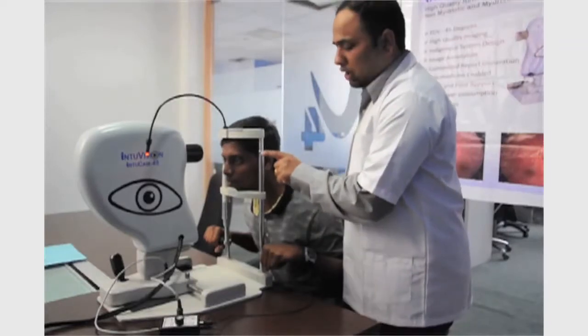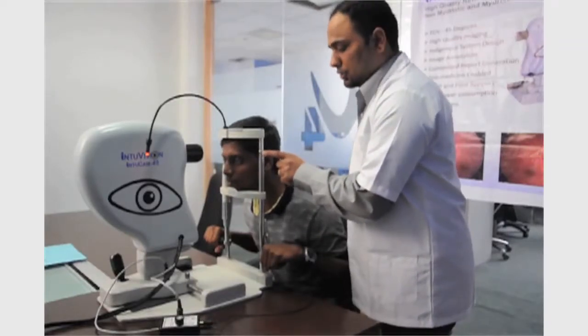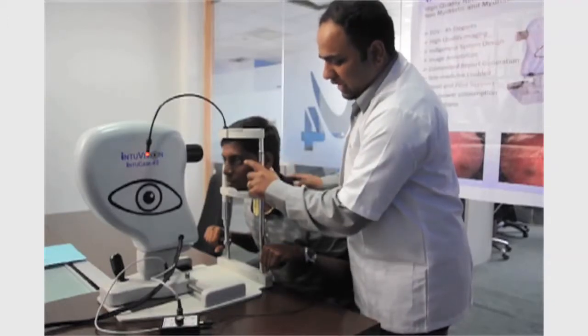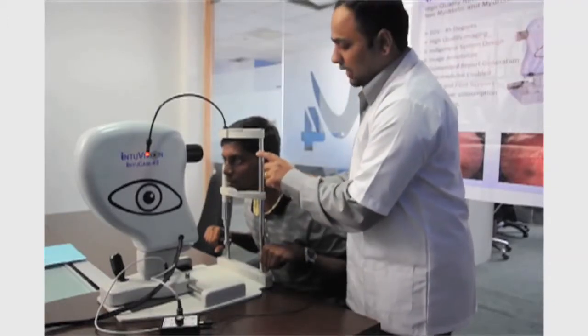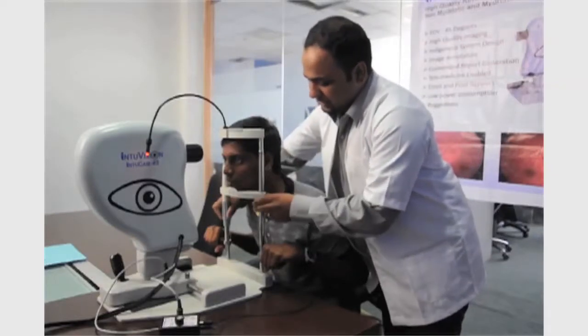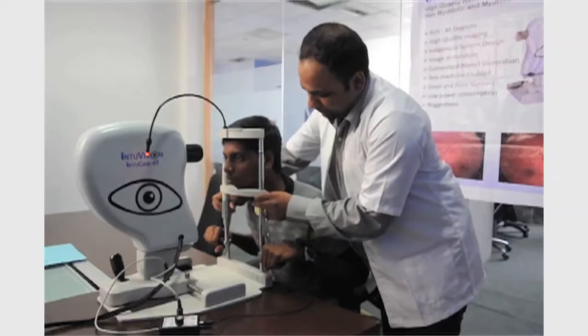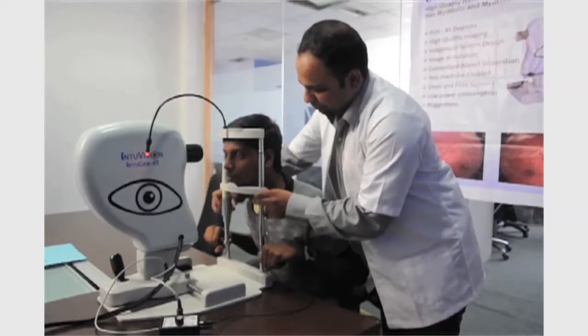You will see a small black ring on the stand which is called the canthus marker. Ideally, the patient's eye should be in line with the canthus marker. In case it is not, please do adjust the height and align them.